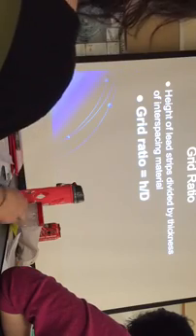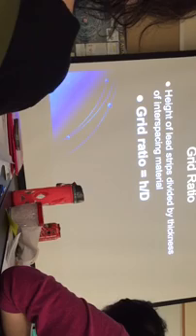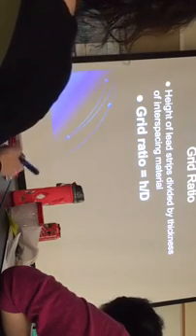It's right here. This grid, for example, is an 8-to-1 grid. So here's the ratio, 8-to-1. You have 6-to-1s, you have 12-to-1s, and the higher the ratio grid, the more cleanup you can do. However, the higher the ratio grid, the more patient dose. And so it is important data that is found here.